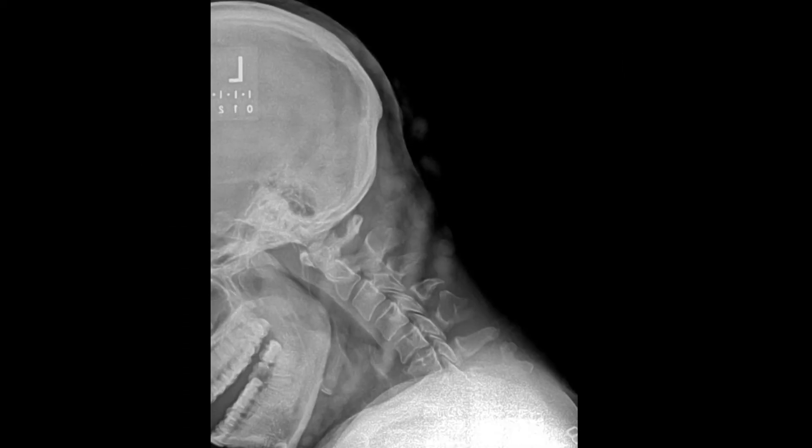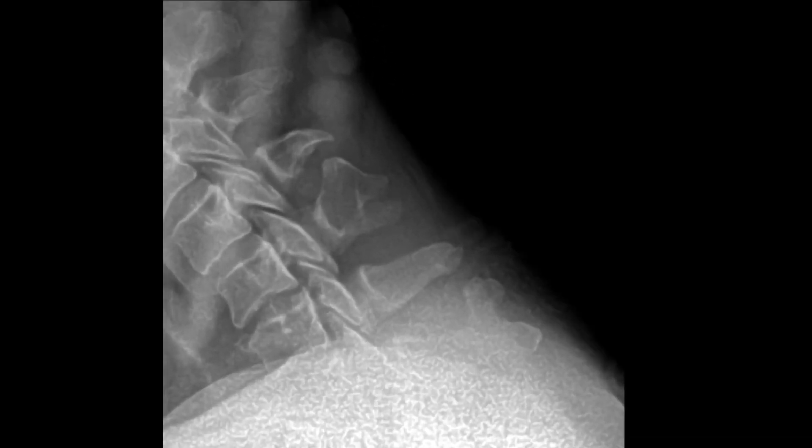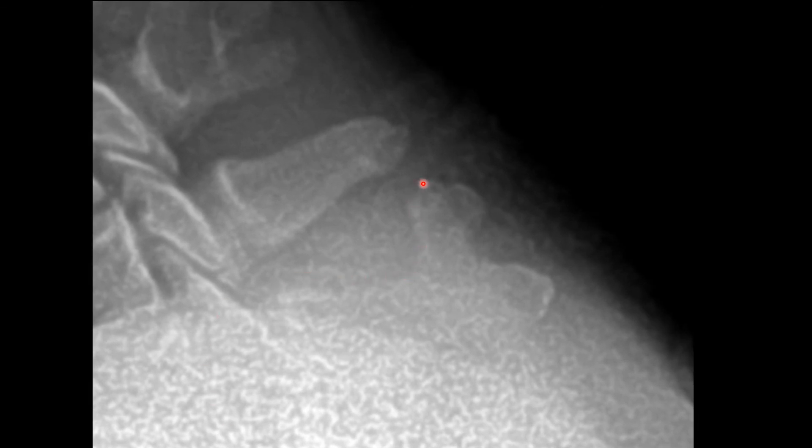This is a flexion view of the cervical spine — take a moment to identify the osteochondroma here. Zooming in, you can see the bony exostosis projecting superiorly off the spinous process.